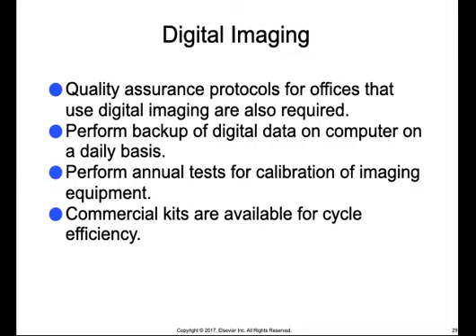These kits include a set of test objects and allow for the following checks: erasure cycle efficiency, image retention, sensitivity, uniformity, scaling errors, blurring artifacts, and resolution.